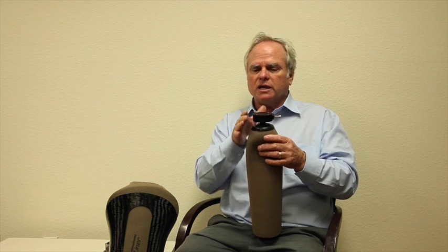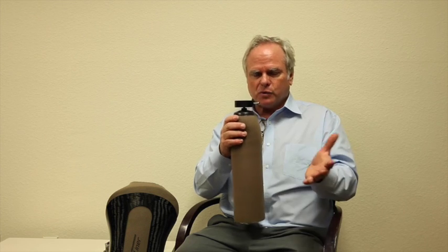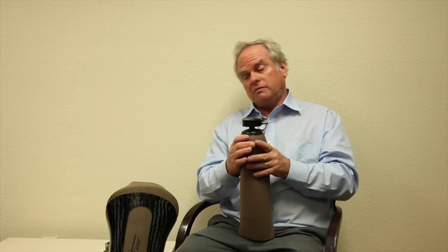So in other words, if I take this off and I put this on, that'll over accentuate it. And if I did a cast, I have an undercut. This dummy is now stuck. And it's going to be an impossible time trying to get it correctly. So put in the silicone rings or fill this in with putty or do whatever you can so there's no undercut and just a smooth transition. So again, the easiest way, go for the mag liner. Check that one out. If it's a liner issue and you're just not comfortable with it, go with your own liner so you can prove it to yourself about the lock, and then try the mag liner.